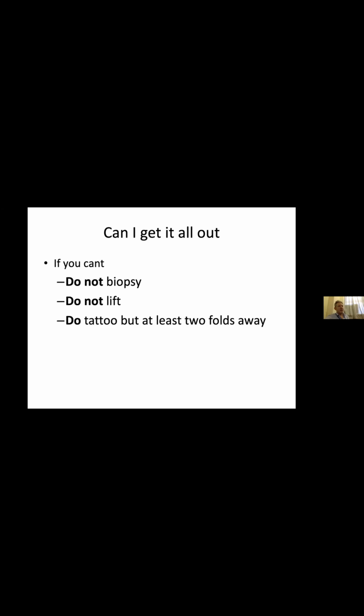So take photographs, ideally take videos. You can take excellent video just by using your cell phone and videoing the screen, or getting the endoscopy nurse to do it. And video gives us a much better idea of the size of the polyp than a static picture, but both are better than nothing.